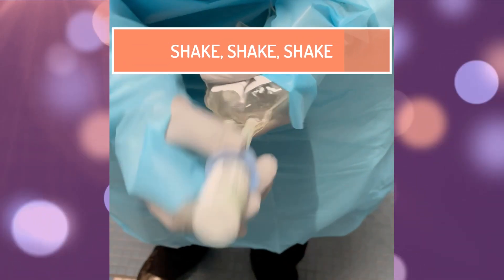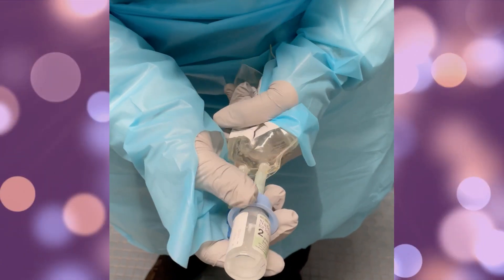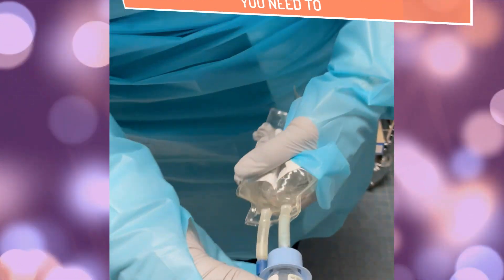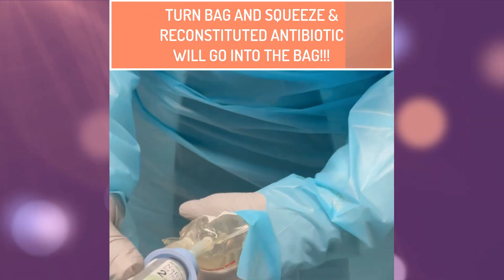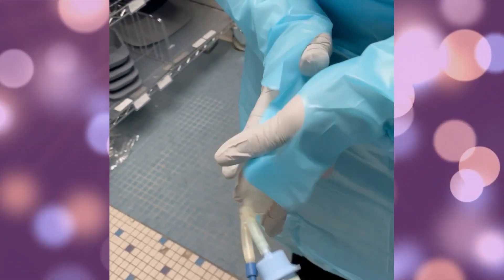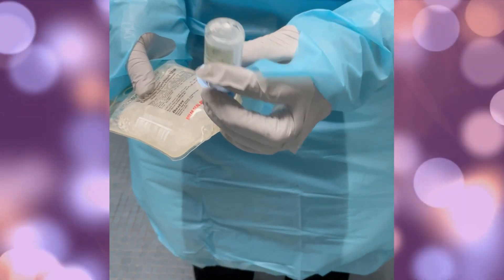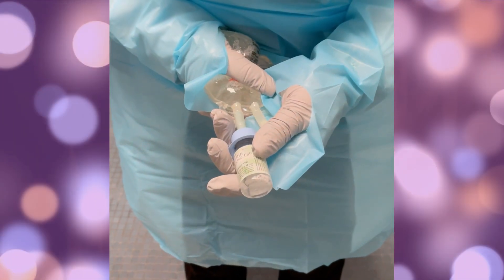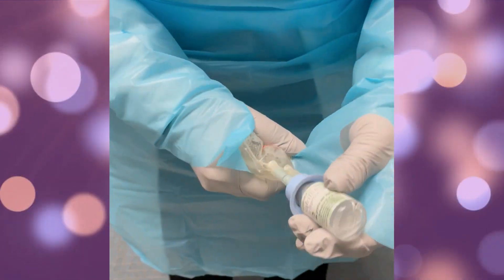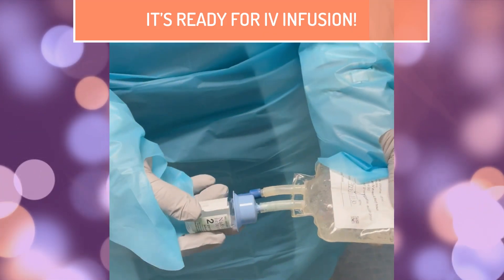You may want to squeeze a little more. Once you see that everything is dissolved — it still has a little bit, so squeeze a little bit more of the saline in. Once you see that it has dissolved, you're going to turn the bag around and squeeze, and the liquid is going to come back into the bag. At that point, you have medication that has been mixed, and it should look just like that — nothing should be in the vial. If there's still a little bit, squeeze some more saline in to get that remaining medication, then turn it around, squeeze, and it will go back into the bag. Then you are ready to connect this to tubing.